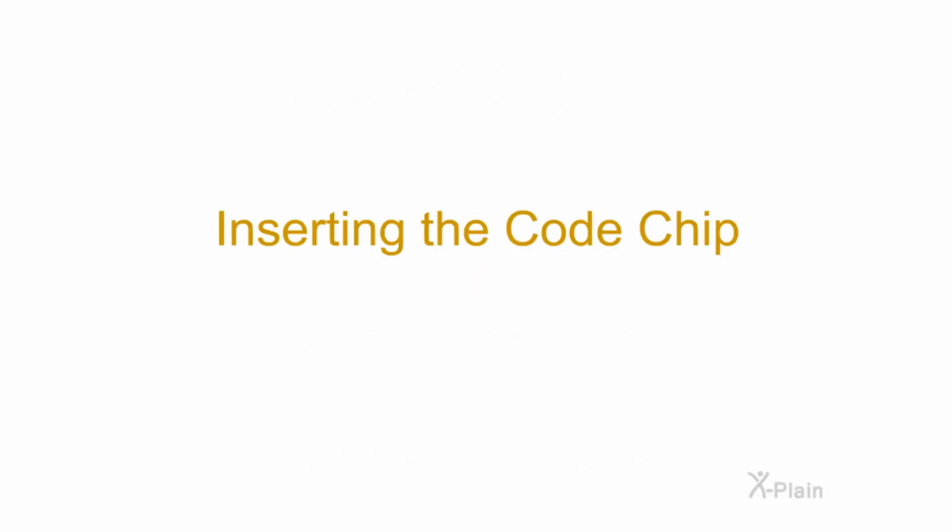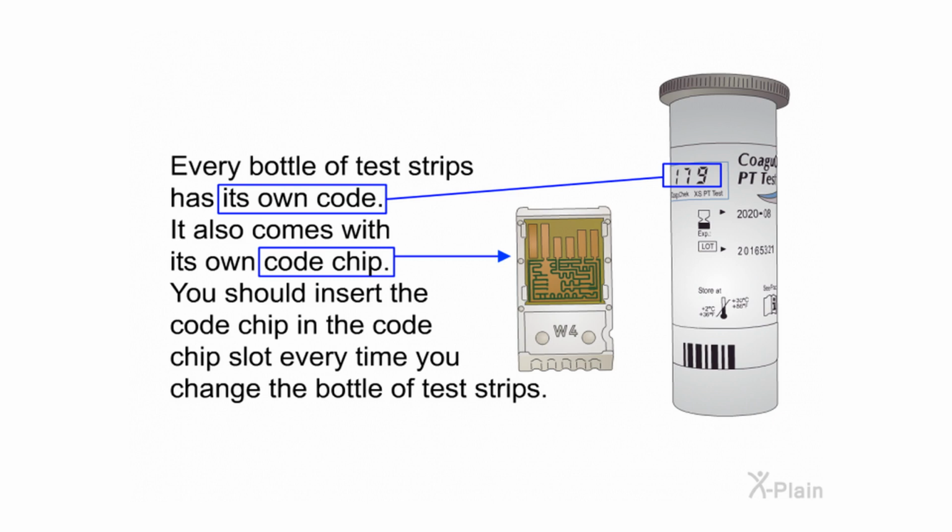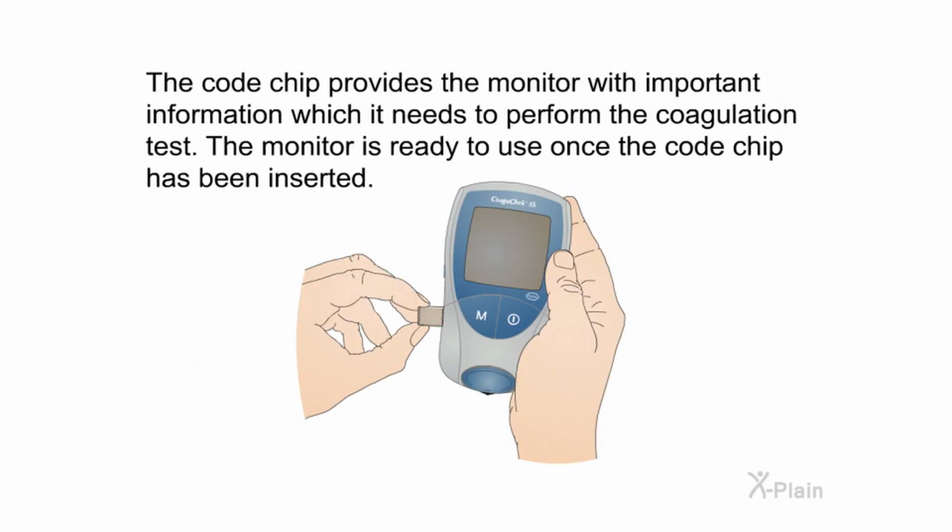Inserting the code chip. Every bottle of test strips has its own code. It also comes with its own code chip. You should insert the code chip in the code chip slot every time you change the bottle of test strips. The code chip provides the monitor with important information which it needs to perform the coagulation test. The monitor is ready to use once the code chip has been inserted.